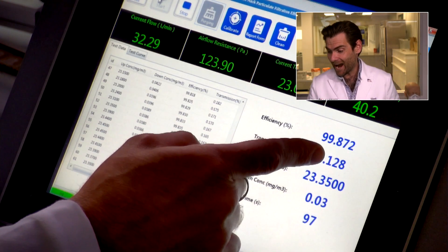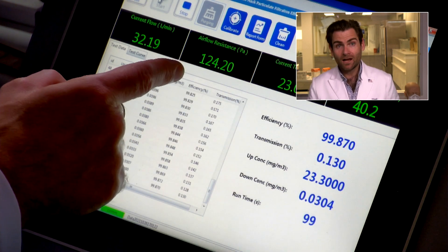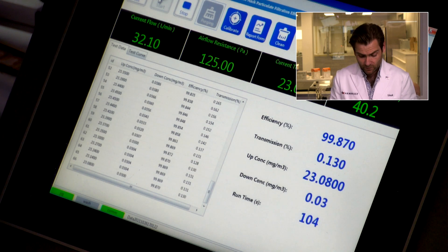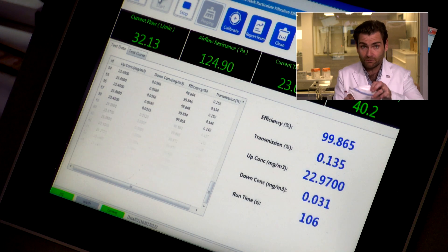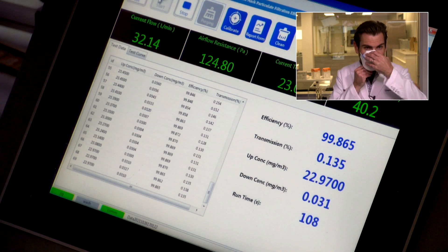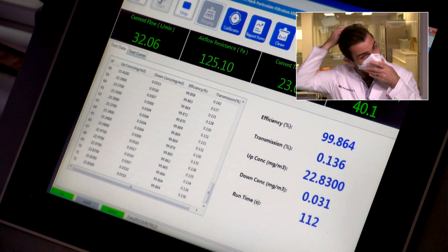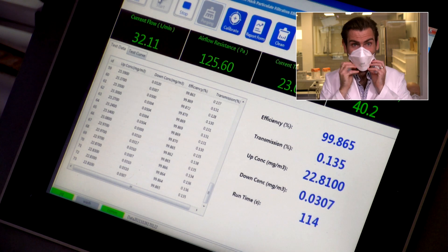The result: 99.8% filtration efficiency, and the airflow resistance is beautiful. It's not the most breathable mask we've tested, but it's up there for sure. I'm going to put this on now — yes, I'm distracting you with the PFE machine so you can't see how horribly I don these masks.